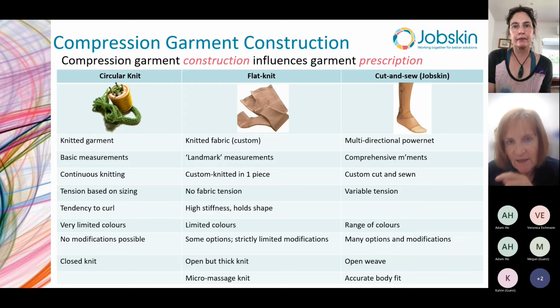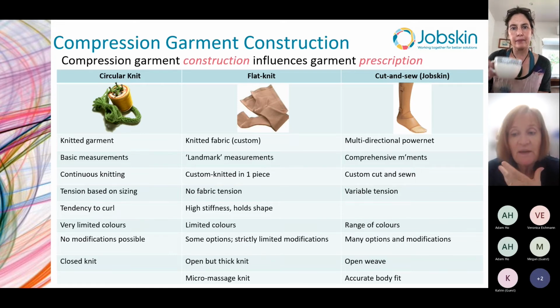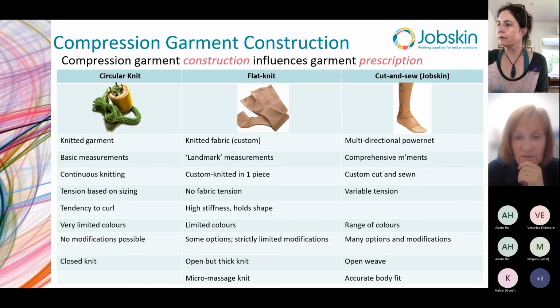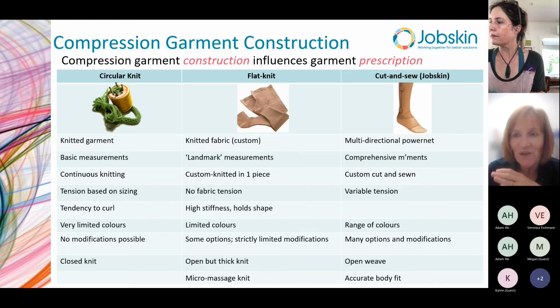One of the real strengths is the variability that can be accommodated. There are no clinical contraindications for the way the garment is constructed or the fabric that is used, but then it comes back to us as the clinicians to make good choices about the garment design. These garment prescriptions can be very challenging, but I've got to say they are incredibly satisfying when you get a good garment, and they also require a lot of patient input. So it really is a true team effort.